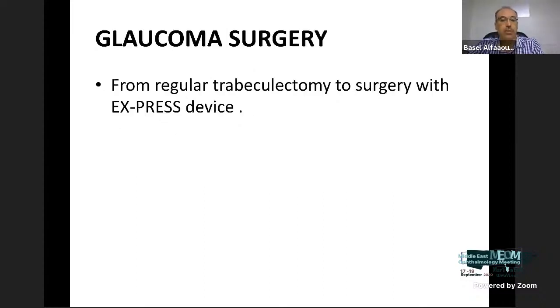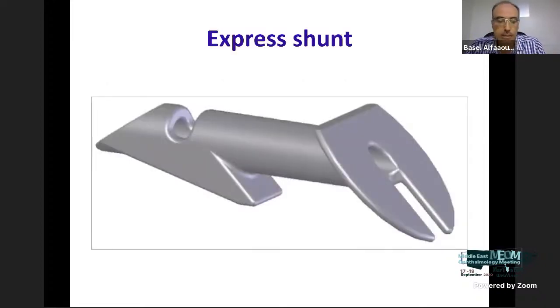But what about glaucoma surgery and the trabeculectomy? The main improvement or the main development in this surgery happened after the Express shunt device became available now in the market, and we can apply it for our patients.